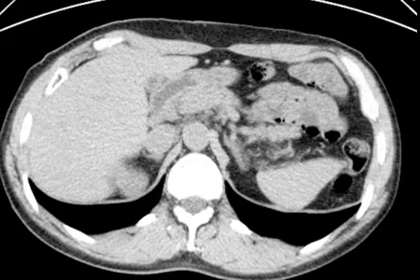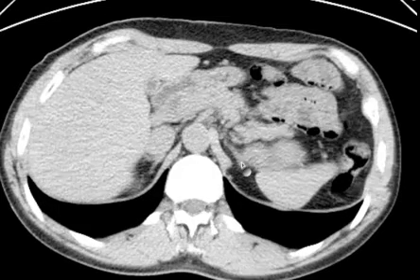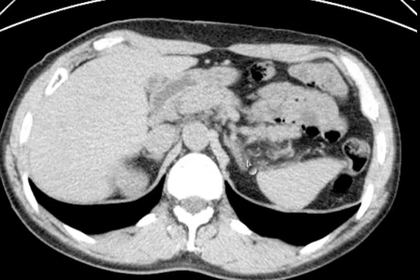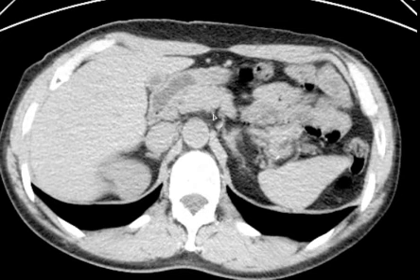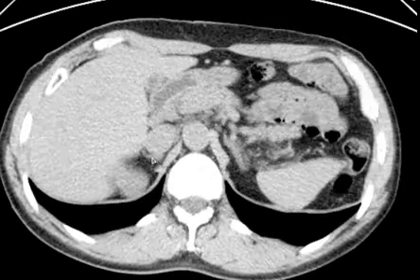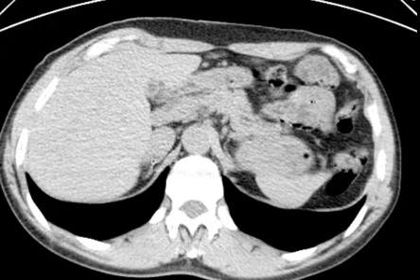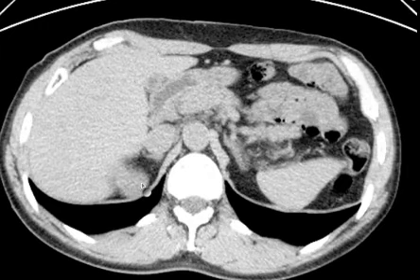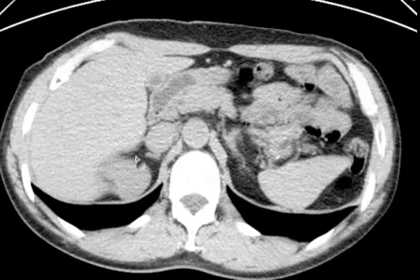Always look for those little adrenals. There's one here. See that little line here? You go down and it's got two legs, two limbs of it over here and here. And here's part of the right adrenal — it has one limb there and the other limb off this way.